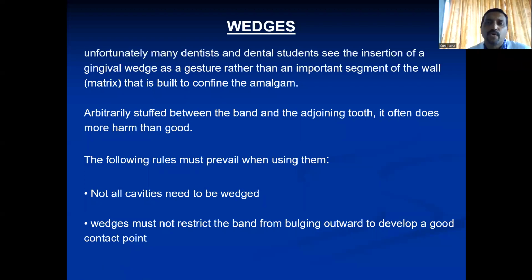Good morning. We are going to discuss wedges used in dentistry. Unfortunately, many dentists and dental students see the insertion of a wedge, or gingival wedge, as a gesture rather than an important segment of the matrix that is built to contain the amalgam. Arbitrarily stuck between the band and the adjoining tooth, it often does more harm than good. The following rules must prevail when using them.